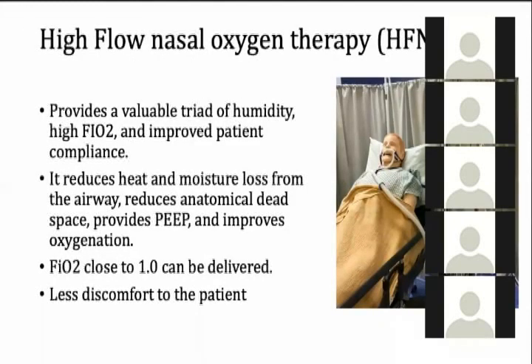And this one, probably you have not seen. This is called a high flow nasal oxygen therapy, where it has a similar interface to a nasal prong, but this is a very expensive and a very efficient gadget. It has its own mechanism to humidify the air, and it can deliver a very high percentage of oxygen. And because it doesn't cause any claustrophobia or symptoms, the patient's compliance is somewhat higher, and close to 100% you can deliver.